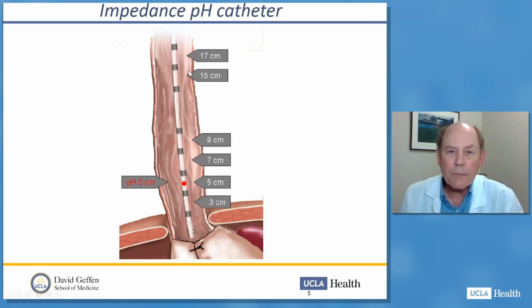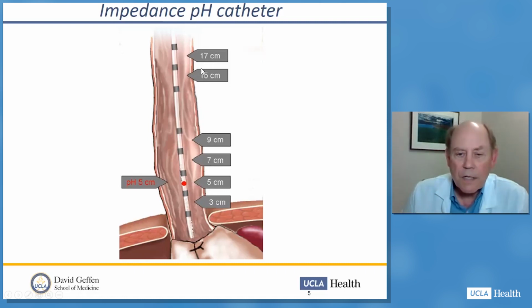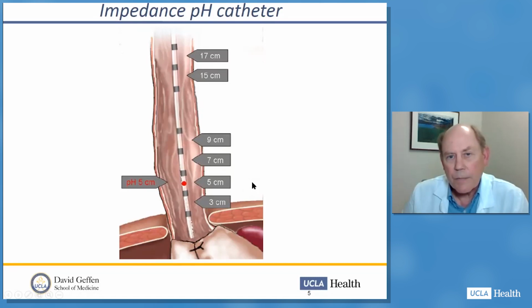So this, most of you are probably familiar with. This is an impedance pH catheter. There is a pH sensor located 5 centimeters above the esophagogastric junction. And then there are pairs of recording excitatory and detection electrodes that are spaced along the catheter in the distal esophagus and more proximal esophagus as well, so that we record impedance events from 3, 5, 7, 9, 15, and 17 centimeters from the esophagogastric junction. This is a typical catheter, but the configurations can be somewhat different from manufacturer to manufacturer.